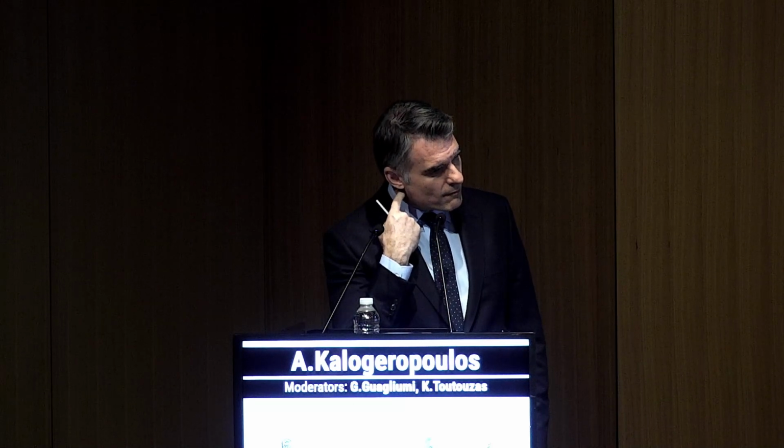Congrats, Andreas. Great case. I would be most worried about the plaque that had the fibrotic recoil, not the mid one, though. The proximal part, yeah, the proximal part for using the DCBs, but it's an excellent result. I wouldn't be worried about the hematoma, and I would leave it like that.